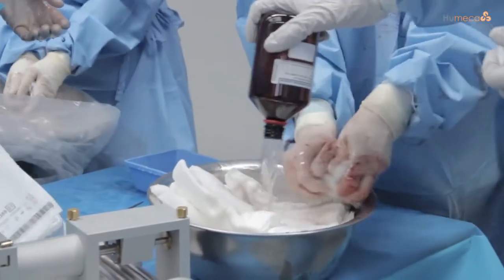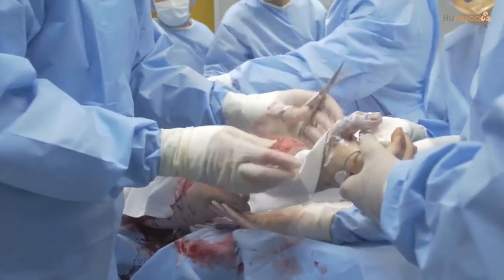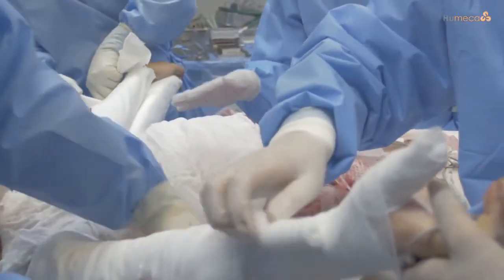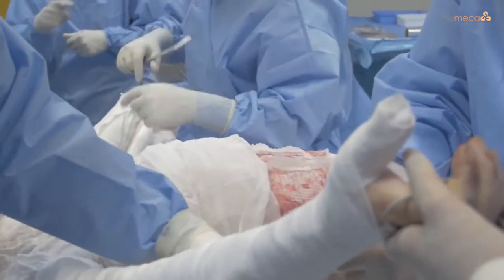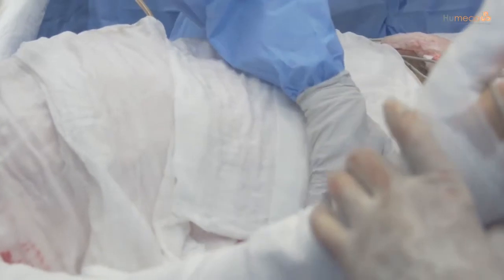Local therapy after the Meek technique is normally no different from the therapy used when applying mesh grafts. In order to have the graft take well, the wound bed is kept moist with suitable outer dressings after transplantation. These outer dressings should not be changed for the first 48 hours; after this period they may be changed daily, but leave the Meek gauzes in place.